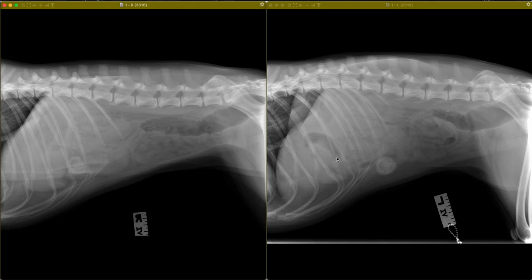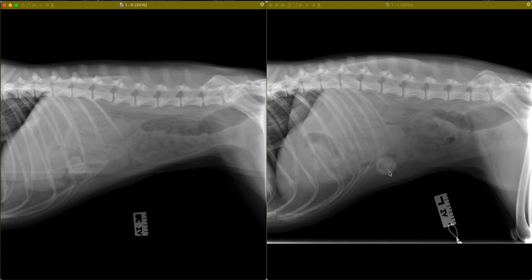The moderately distended proximal duodenum is poorly defined beyond the point where it becomes more uniformly soft tissue opaque. Between the right and left lateral views, we consistently see a moderately distended segment of small intestine in the mid to cranial abdomen. It begins to taper at a minerally opaque structure that is inconsistent with normal ingesta, has a uniformly thick wall, and centrally has both heterogeneous mineral and fat opaque material. This structure has a uniform appearance between both lateral views and is very consistent in its location in the cranioventral abdomen.